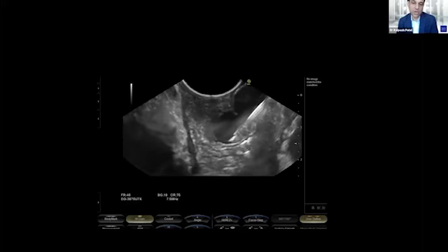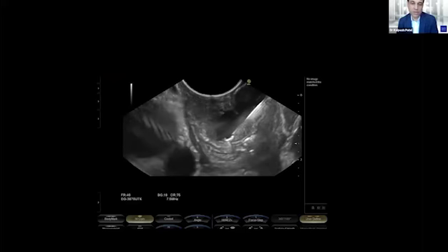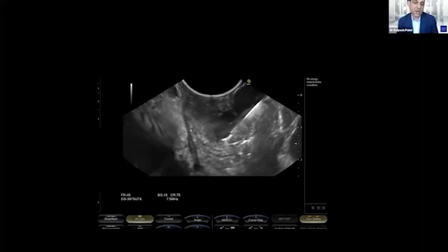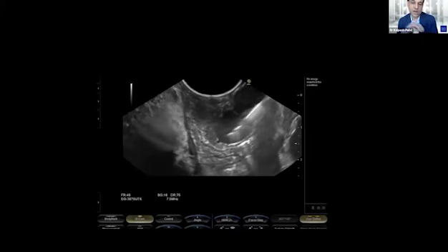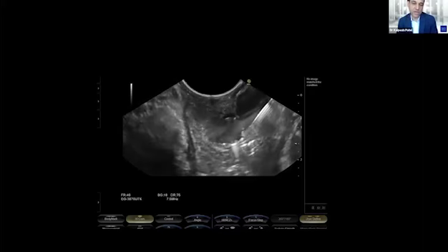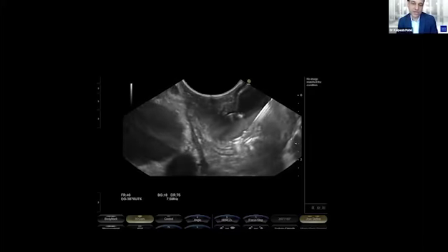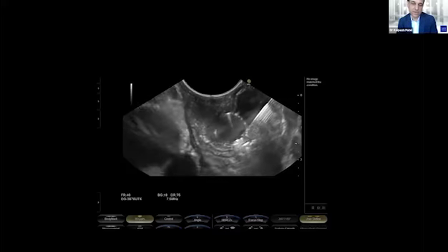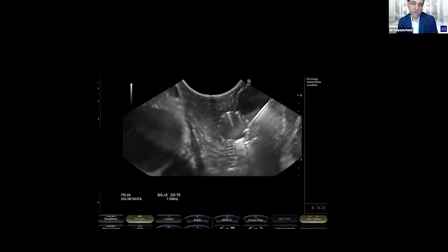Through the needle, we're going to begin the coil deployment, and you'll see it take a very nice shape. We want to start sort of in the back end of the varix and work our way towards the GI lumen side and sort of filling in as we go. And here you can see a very nice coiling effect as the coil emerges.